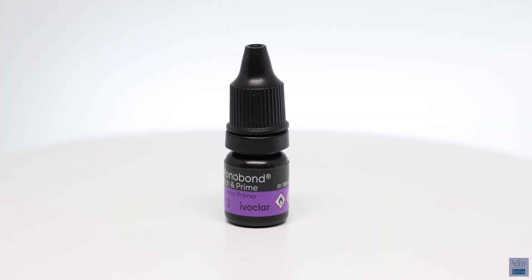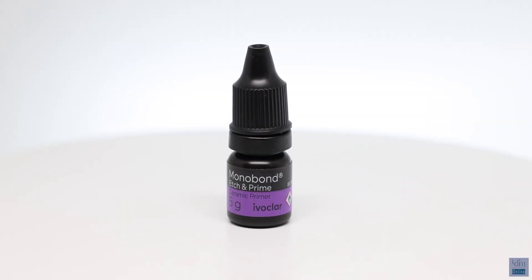I do not shift primers easily, whether it be for dentin and enamel or for ceramic, but this one has worked really well for me. I want to review that with you on this video tutorial on my method, because when we pay attention to the details — it's all about the details. It needs to be routine. We have to be precise. We have to look at the minute things, and when we do that in adhesive dentistry, it works really well. So this is about the Monobond Etch and Prime.